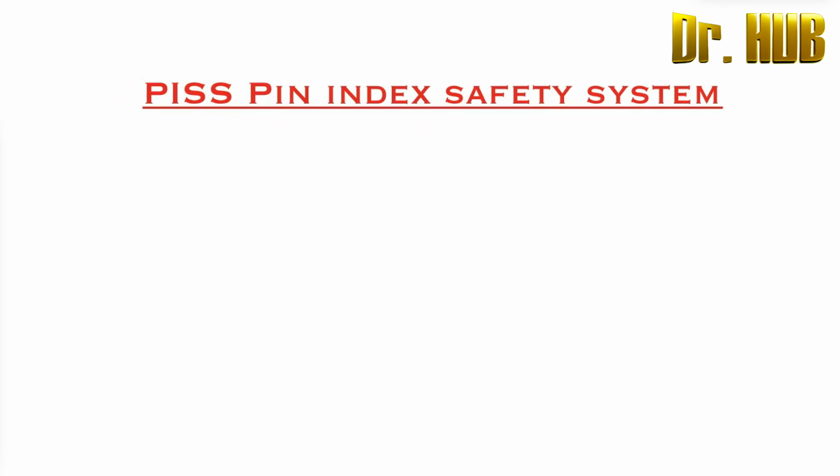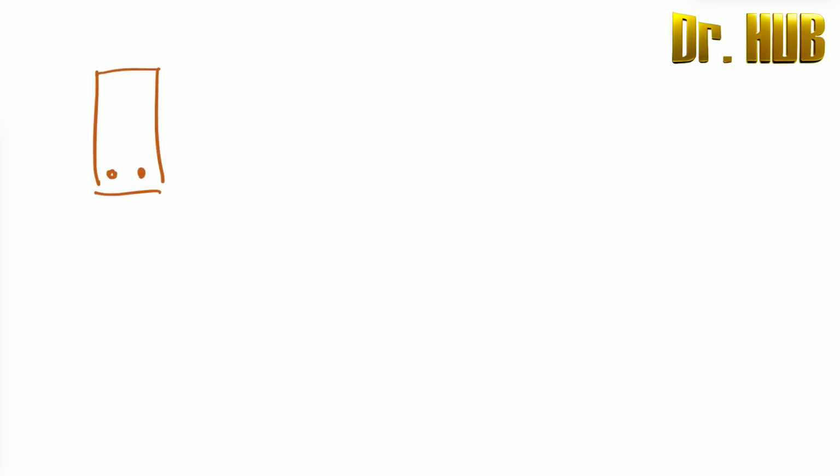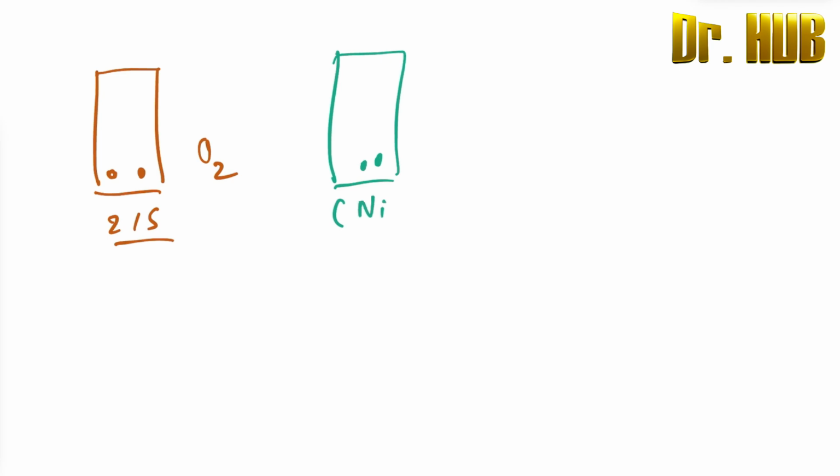PISS, or the Pin Index Safety System. Each gas will have a particular pin safety system. So let's look at it. Here this pin signifies the 2 and 5 position. So this is oxygen. Next is nitrous oxide. Nitrous oxide is 3 and 5. So the 5 remains constant. 5 is here and then 3 is towards this. So this will be nitrous oxide. The position here is going to be 3:5.